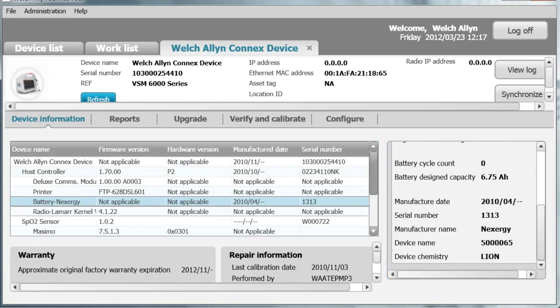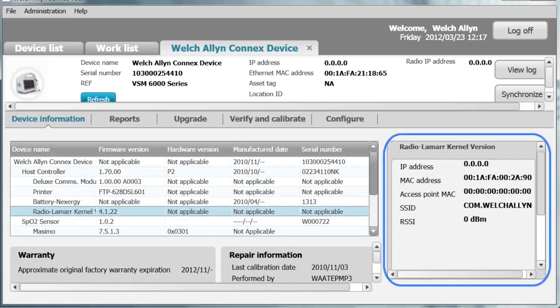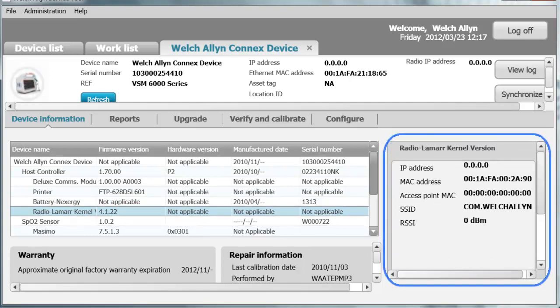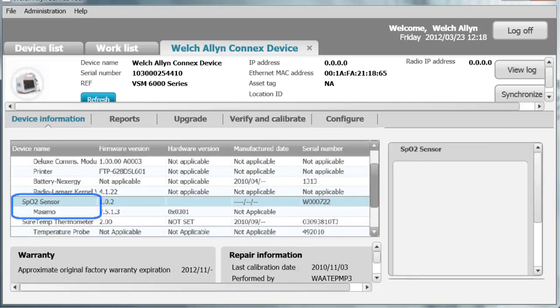Next on the host controller is the radio, a Lamar radio. When you click on that, you can see the MAC address, the IP address, the access point, the SSID, and the RSSI. When you click on the SPO2 sensor, you will see either Massimo or Nelcor listed here.